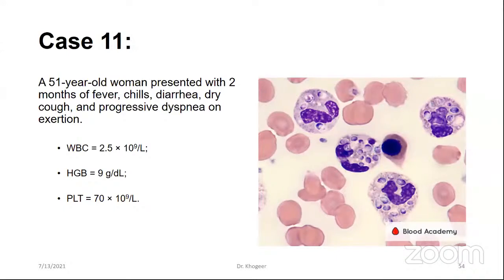Can we see toxic granulation in hemolysis? Not usually. Toxic granulation is mainly seen in infection, inflammatory processes, and malignancy. In hemolysis in particular, it is not a part of the picture, unless the hemolyzed patient also has an infection or inflammatory process.